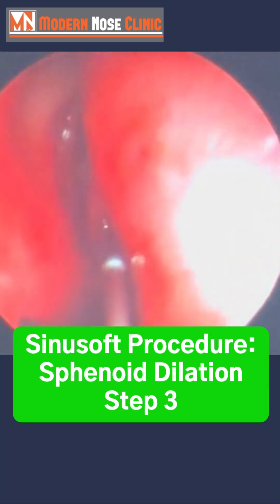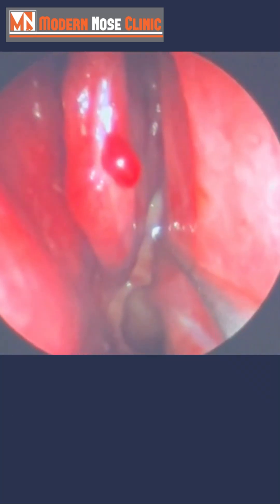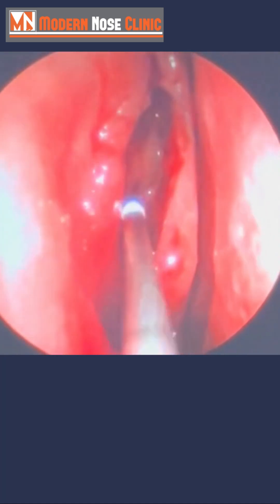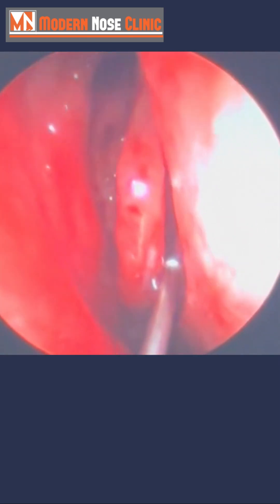We're going to do the sphenoid sinus now. Moving in on her right nostril, coming back here — this is the middle turbinate, and this is the septum, which has been fixed. See how skinny this is now? Air can flow on this side to ventilate the sinuses. The frontal sinus we did already. Coming back here, the sphenoid sinus.